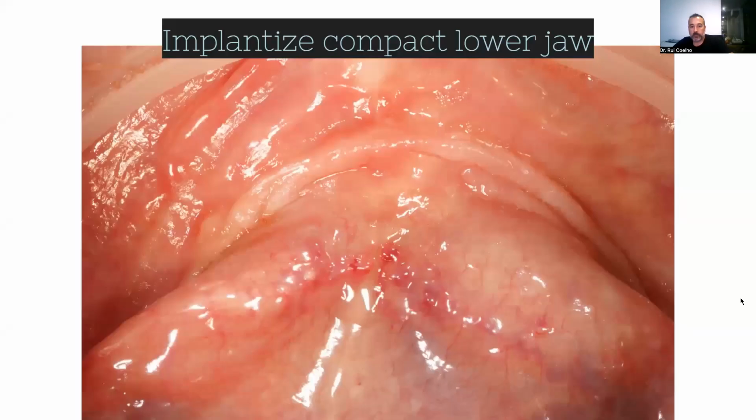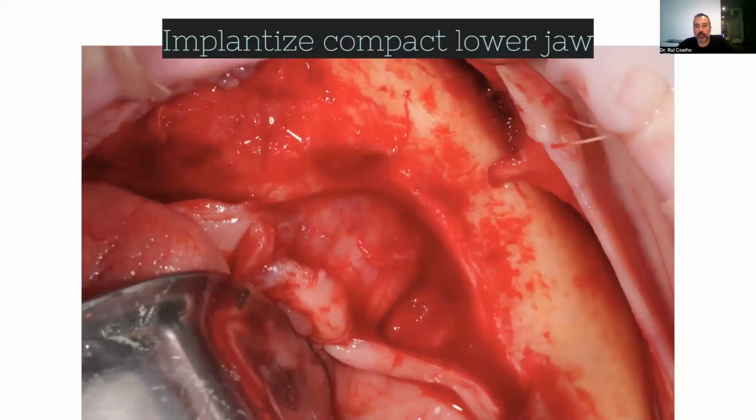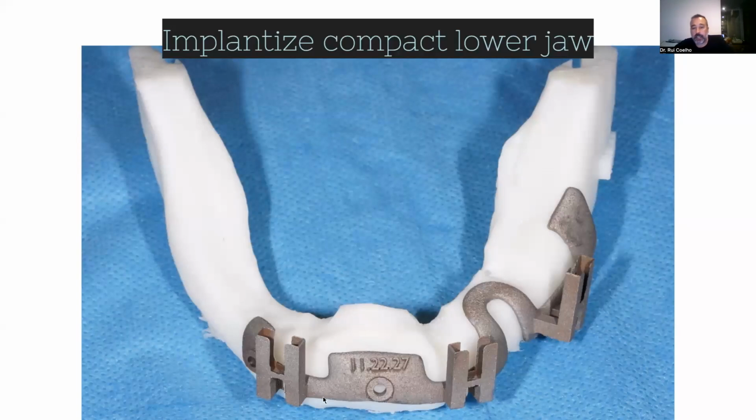Sorry. So let's go for a case, an inferior case. So it's a regular opening, like it is for a subperiosteal, you see. And again, the guide, this is an ancient guide, and also the burrs were the first ones. But you see, we try to make a chamfer here on these two points. If we have a negative crest, we don't even need to do it, okay?